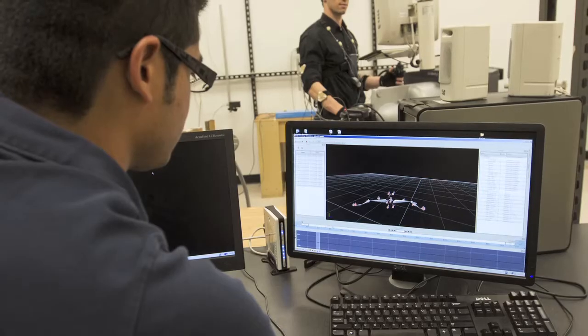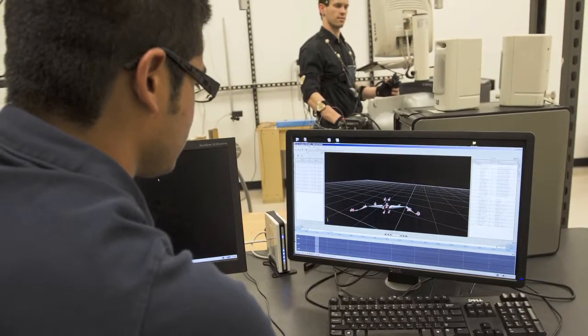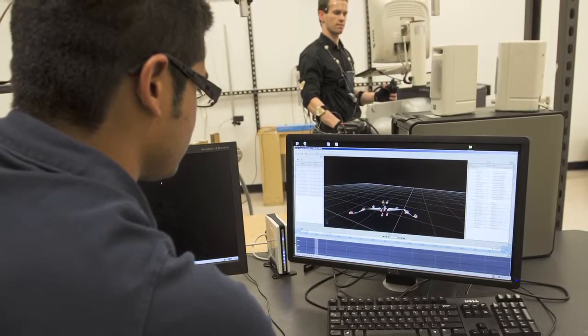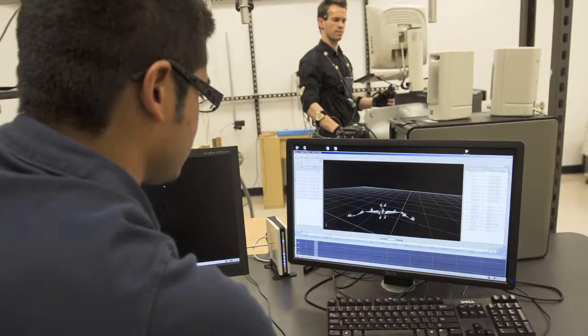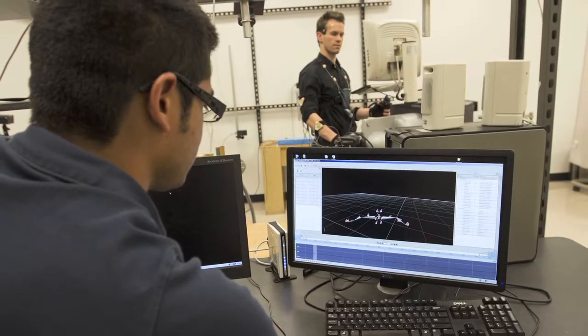So I came to the clinic, I looked at some of the procedures, and this is how this project kind of took off. The contribution that we thought we could provide to this problem was actually quantifying the movement patterns that endoscopists generate during these maneuvers. And in particular, trying to link the movement patterns with the likelihood of causing these particular injuries, which are fairly serious. As you taught us, these overuse injuries can actually be fairly debilitating for the endoscopists, right?